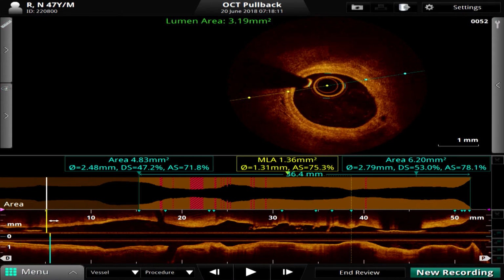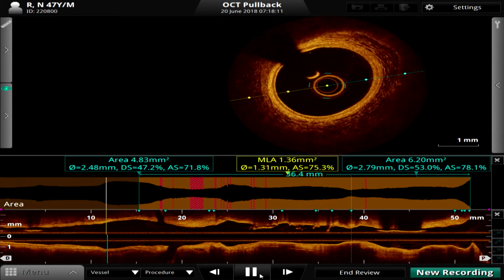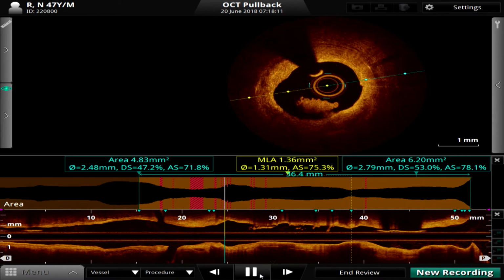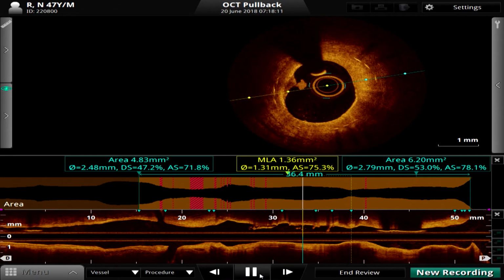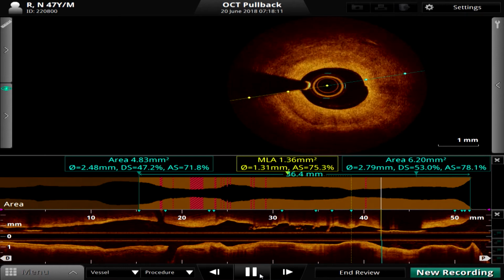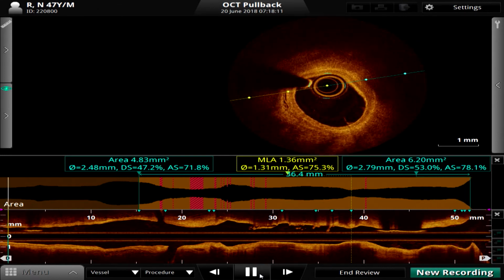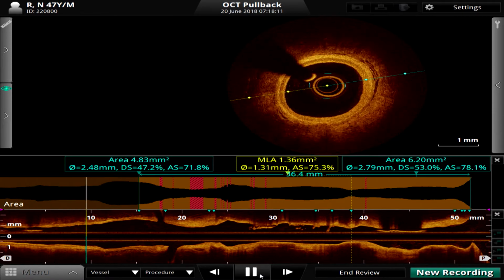And I think your OCT very beautifully demonstrated the ruptured TCFA distal to the stent. It almost seems like that may have been the culprit lesion that then propagated proximally into the stent areas too. In all of these cases, whenever you're dealing with thrombus within stents, you have to pause and think whether putting another stent would be beneficial. And in this case, I would agree that putting a new longer stent covering the distal and proximal portions would probably be the way to go.